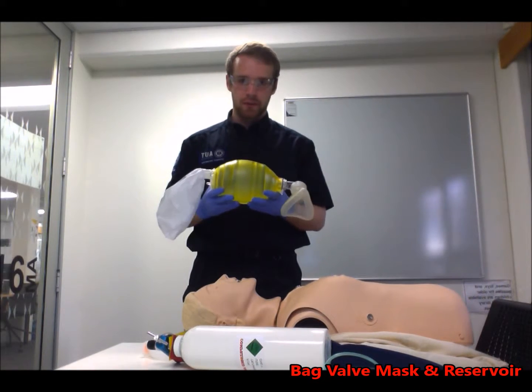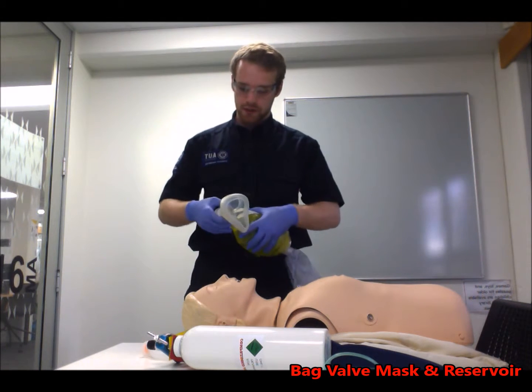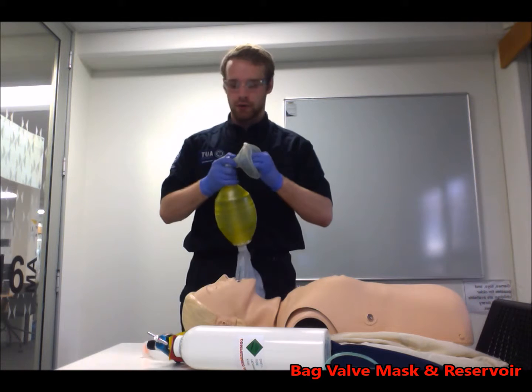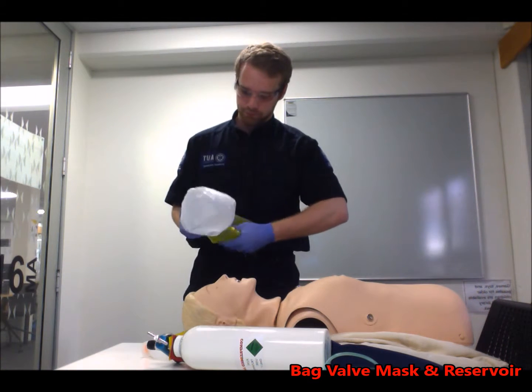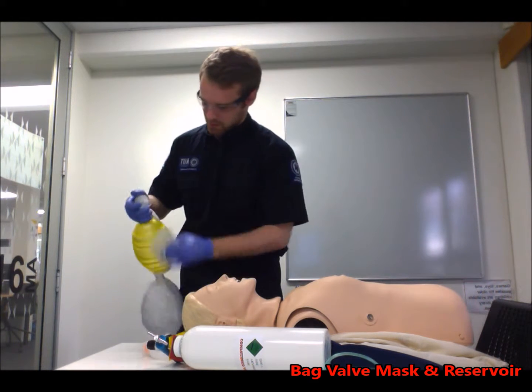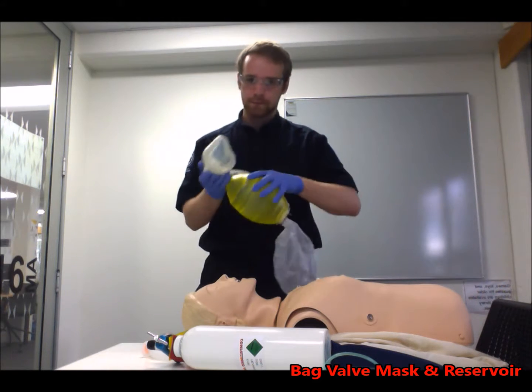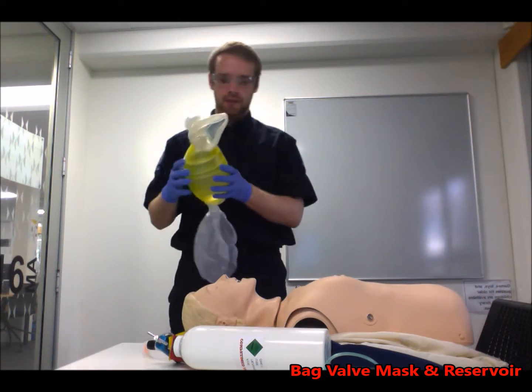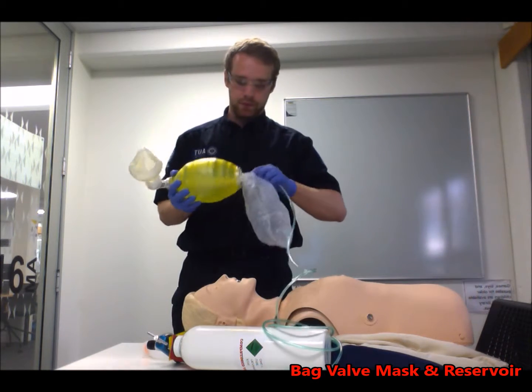Next I'll be showing the proper use of a bag valve mask and reservoir. So what you want to do first is check that both sides have no leaks. So you take this off. So that's alright, it has no leaks in there. And again, yeah, that's going well, so that's fine. So next you want to attach the bag valve mask to oxygen.